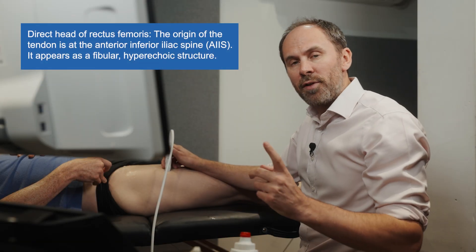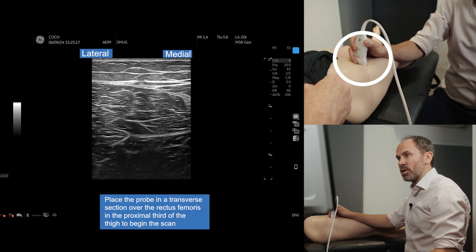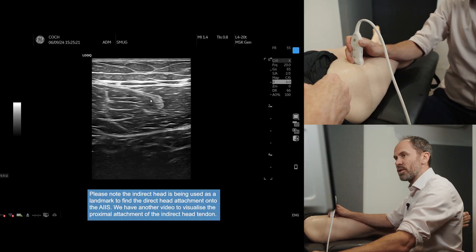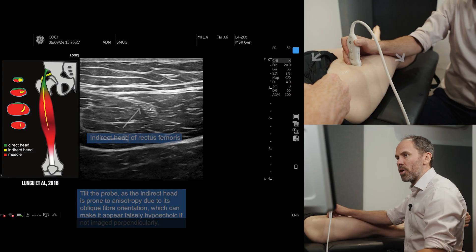Now I'm going to show you the direct head of REC-FEM. Remember, we do have an indirect head of REC-FEM video as well. So if we pop the probe in transverse section on the rectus femoris muscle belly, you can see the tendon that's sitting in the middle there. Now it is prone to anisotropy, so if you can't find it, make sure you're just tilting your probe.